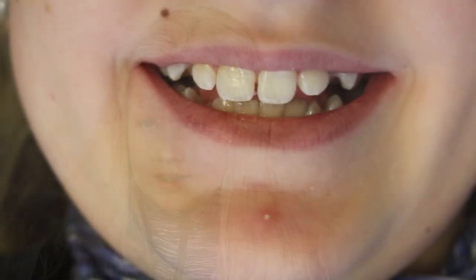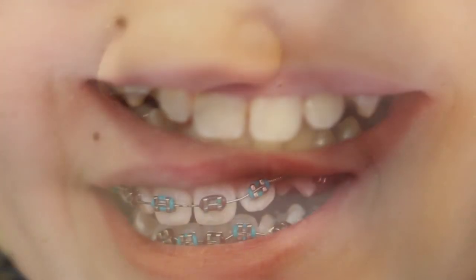My teeth feel tight and I feel like they're going to get straighter soon. The brackets felt awkward in my mouth because I'm not used to them. It takes a little while to get everything on and together.